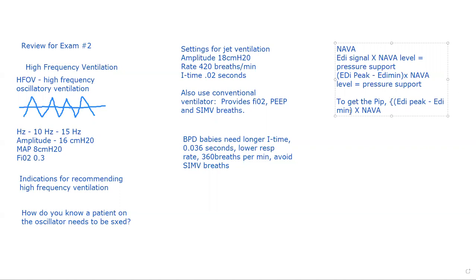EDI peak minus minimum, times the NAVA level, plus PEEP, equals PIP. So I think that's what I gave you guys in your notes.